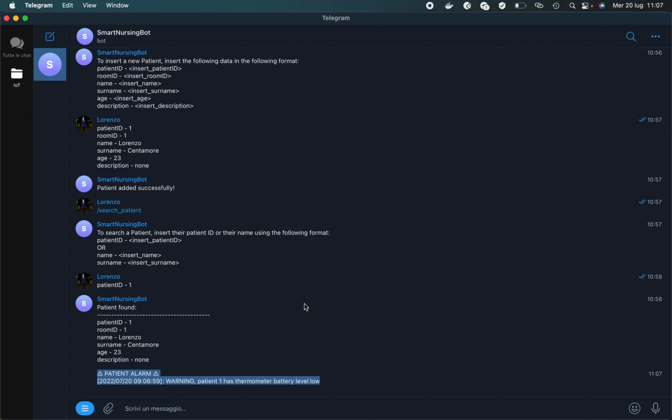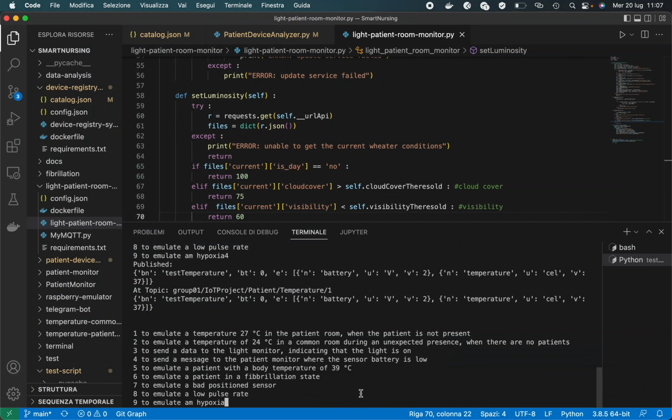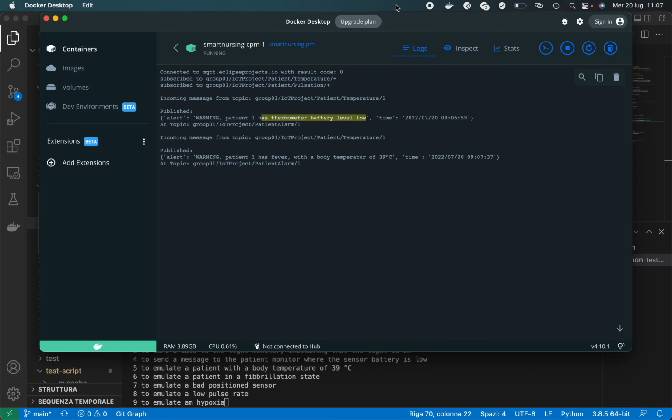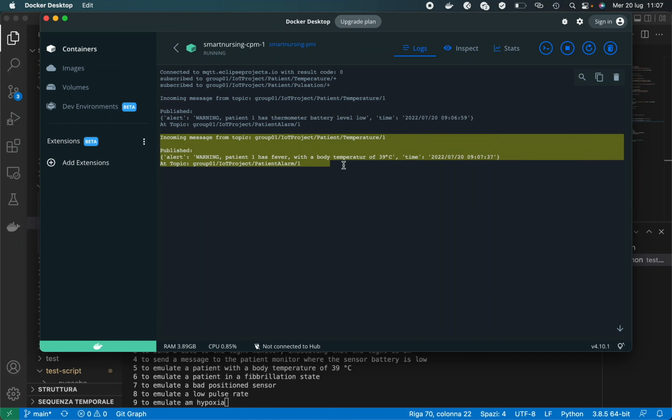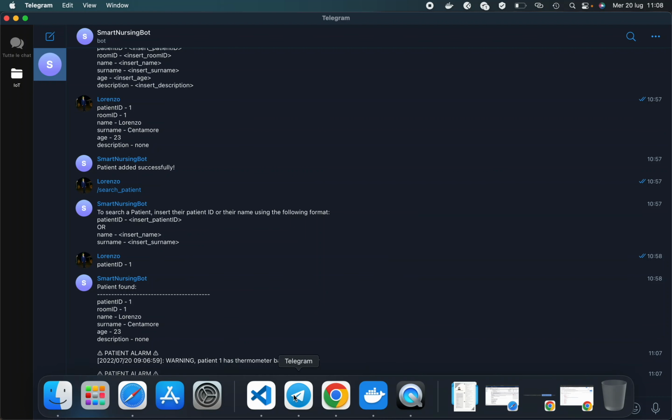Now, pressing 5, I will emulate a body temperature for patient 1 of 39 degrees. Since this value is higher than a threshold set by us, the nurse will receive a notification on Telegram. Let's first check the output of the container and then check the notification on Telegram. Here is the publish of the message. Here is the notification.